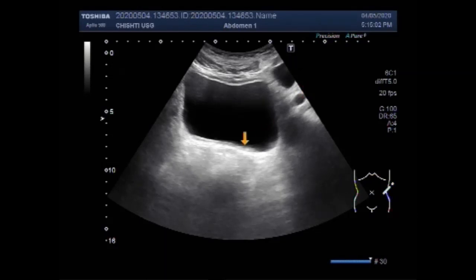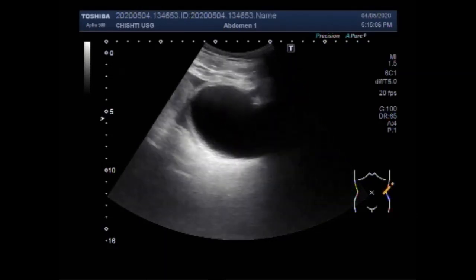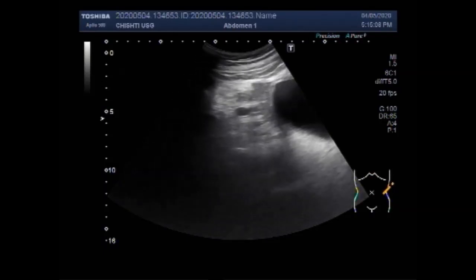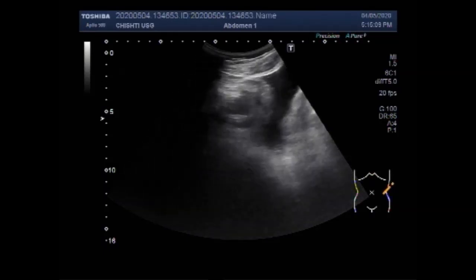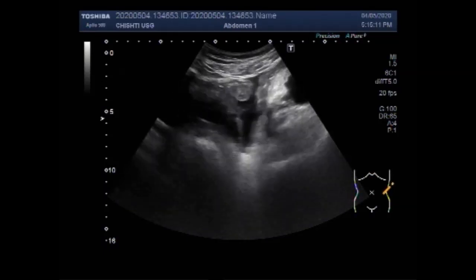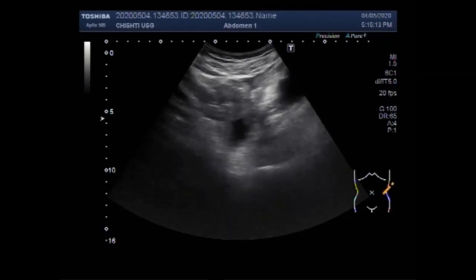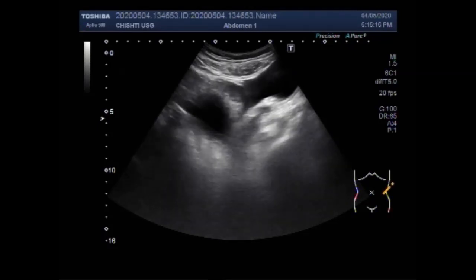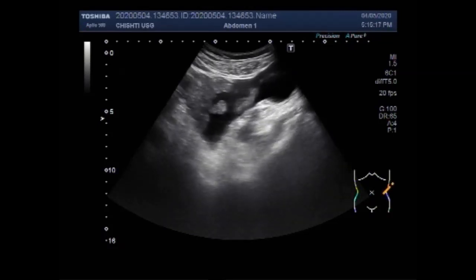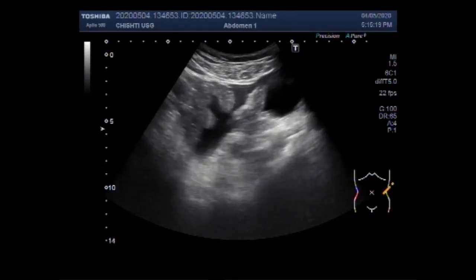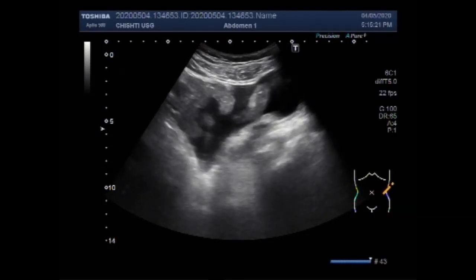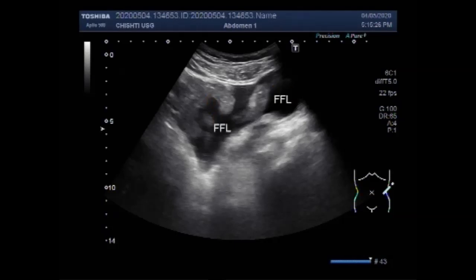Now you are going to see the lower abdominal cavity. This is the urinary bladder. And you can see a significant amount of free fluid seen in the lower abdominal cavity. So the fluid is seen in the lower as well as in the upper abdominal cavity. The gut loops are floating in the fluid present in the abdominal cavity. This is free fluid — these are the gut loops.